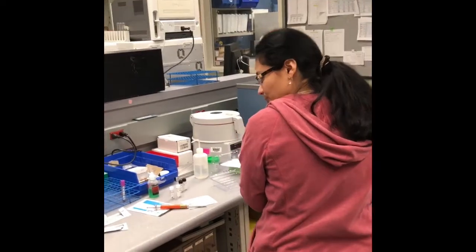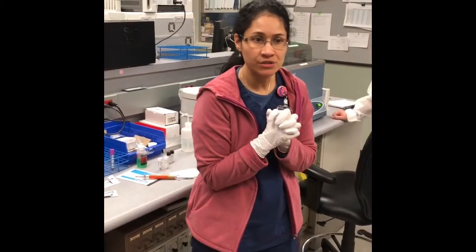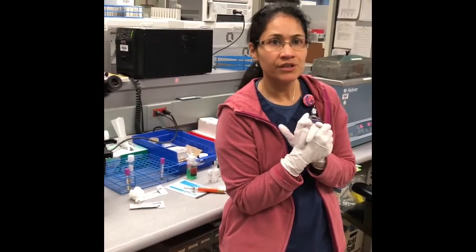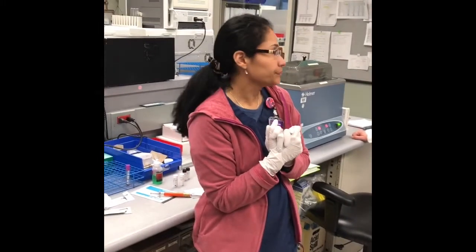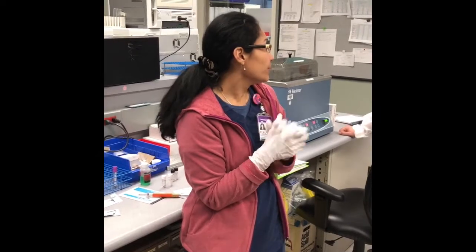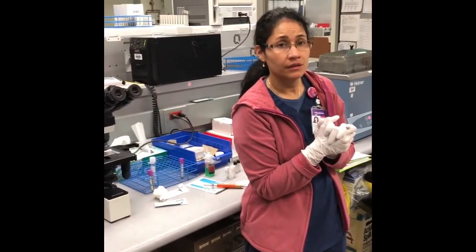What else can we do? Not that hard. Nobody wants to count. I would have to do the differentiation of the cells, counting the differentials. Everyone is good on differentials, right? I am. We've been doing them. I think everybody is competent. Most of the cells that we see will be neutrophils, lymphocytes, monos. It's just a backup, having to use the hemocytometer.